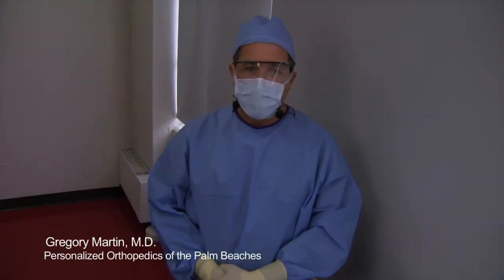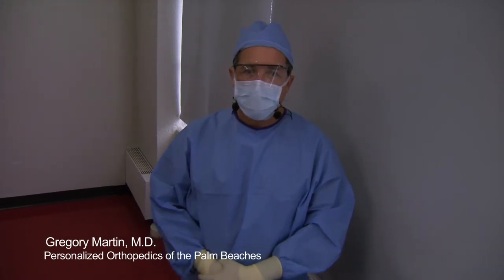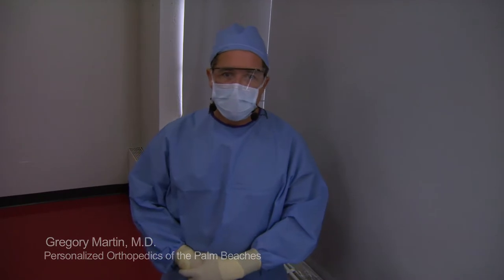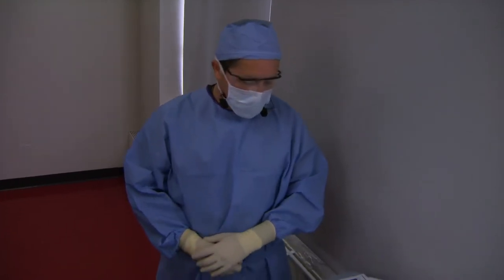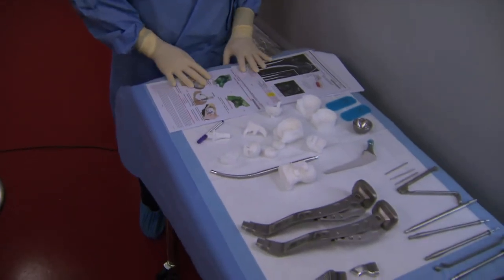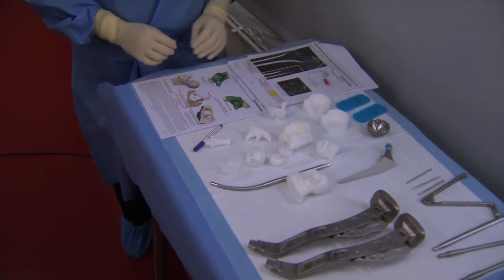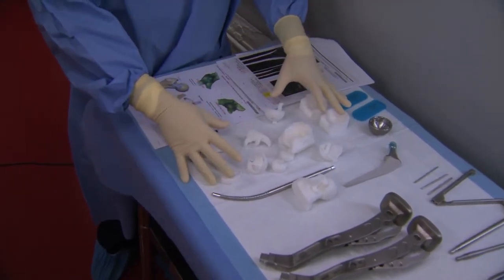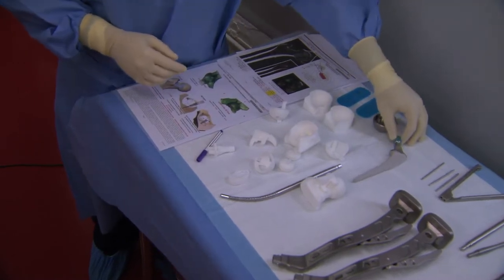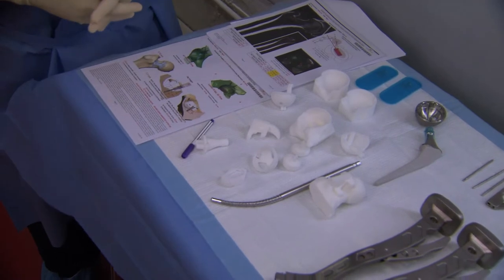Hello, I'm Dr. Gregory Martin, and today we're going to be utilizing the Conformis Hip System. This is the first patient-specific hip system to be launched here in the United States. The advantages of the system are we have a preoperative plan, which is all mapped out according to the patient. We give you the tools to execute that plan, and then finally we give you a patient-specific implant system which matches the patient's anatomy with precision.